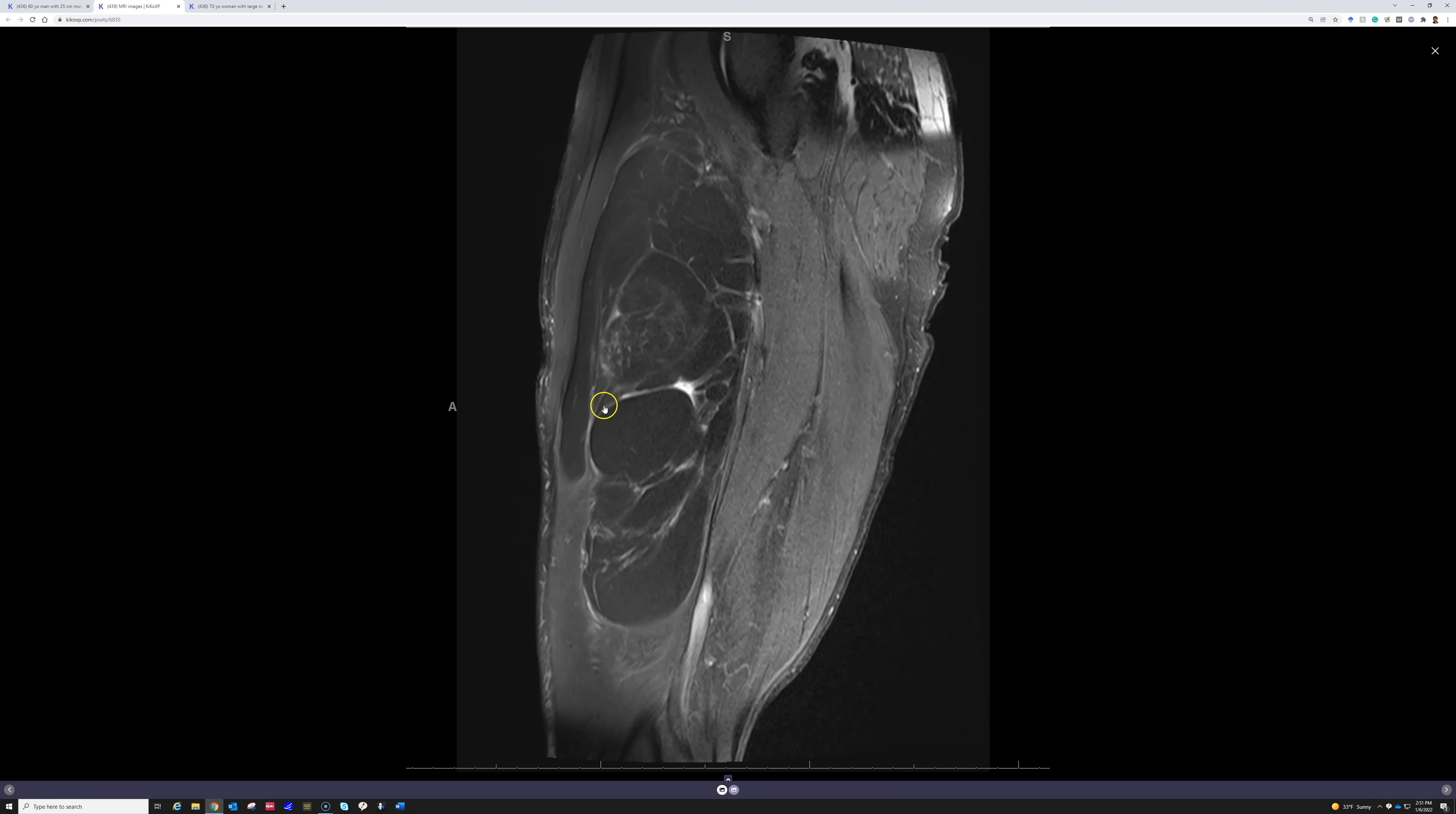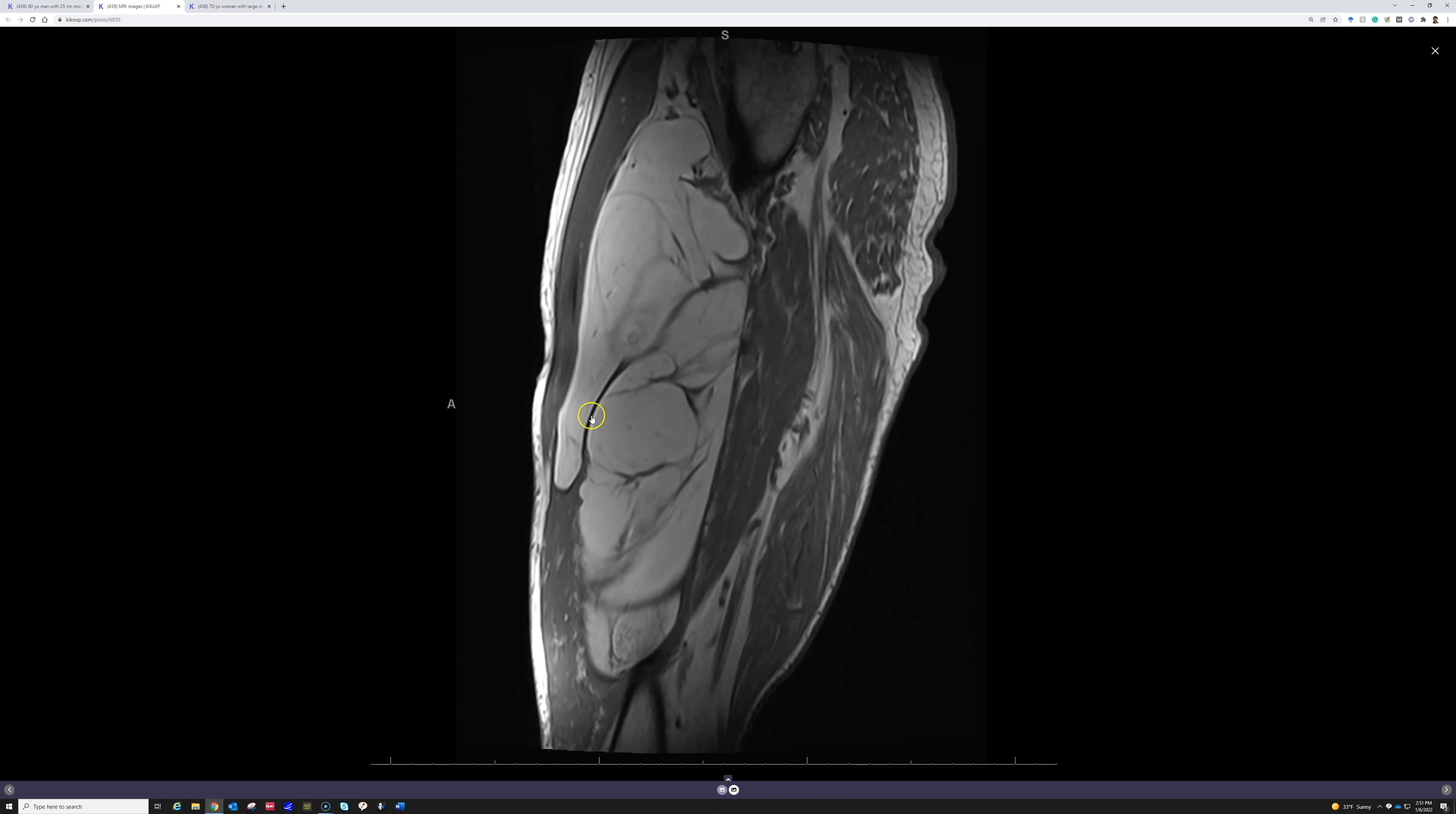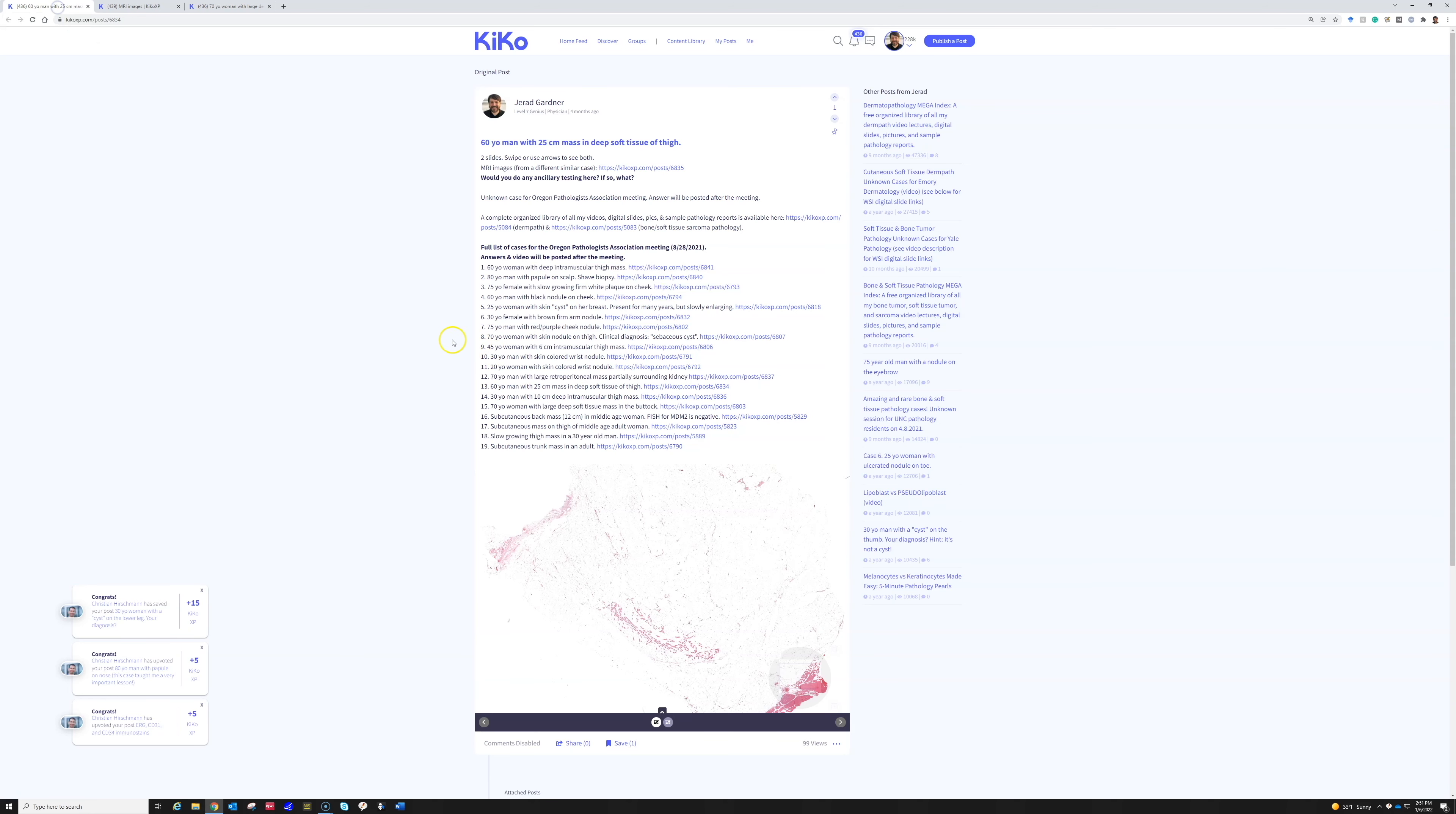And here's a different view and you can see it is all fatty and the signal intensity is the same as the subcutaneous fat right here. But you can see these dark fibrous bands running through it. So that's a very classic example here.